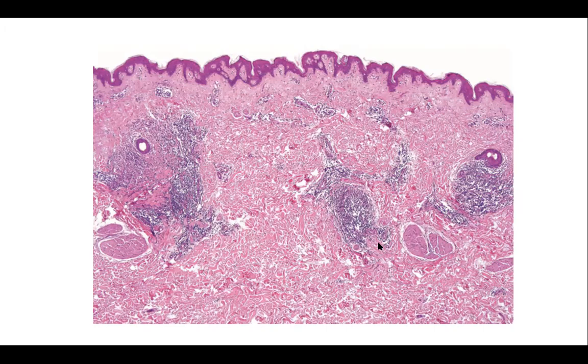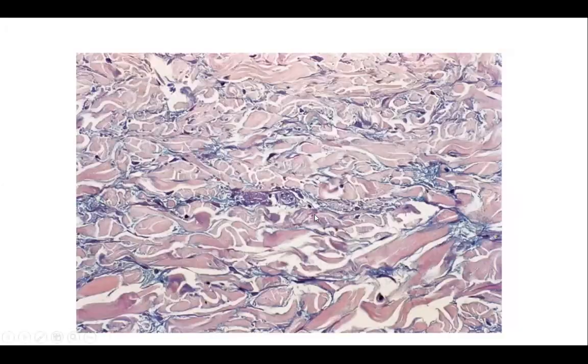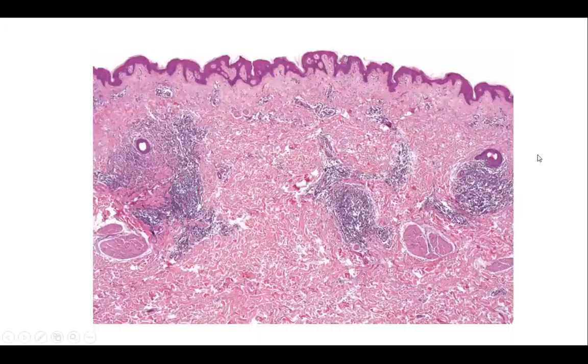There's a patchy, large perivascular infiltrate, superficial and deep perivascular infiltrate. Would you guys want to order any stains or markers here? Mishal wants mucin. Okay, we'll go for mucin for Mishal. So mucin is positive. So let's go back. There is no epidermal change though. No interface. Tumid lupus? So tumid lupus, very good.